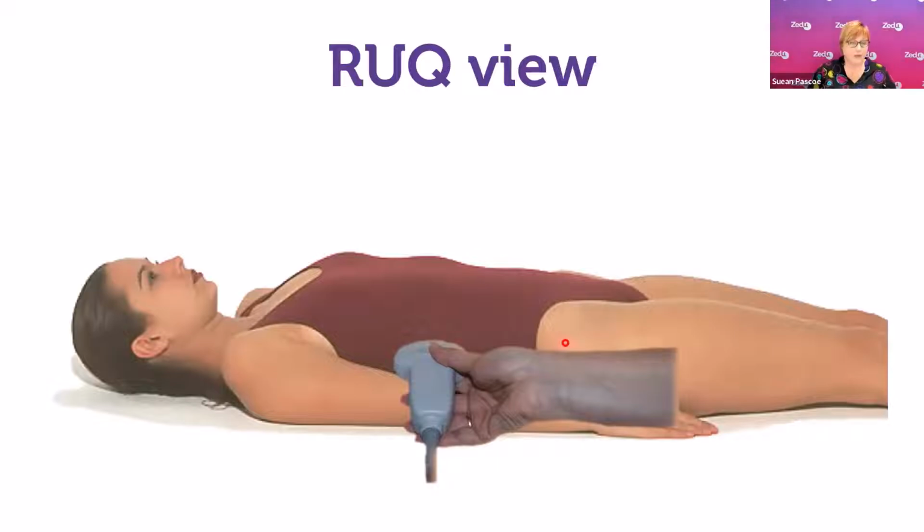So this is where the overflow of fluid will sit. And fluid in the right upper quadrant has a high predictive ratio that they need surgical intervention to fix it. So the likelihood ratio is something like 112 times the likelihood ratio that they need a surgical management to fix the problem. And so the technique is the same for the right upper quadrant view of this, the FAST exam.